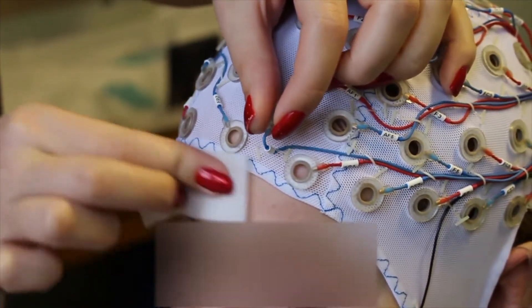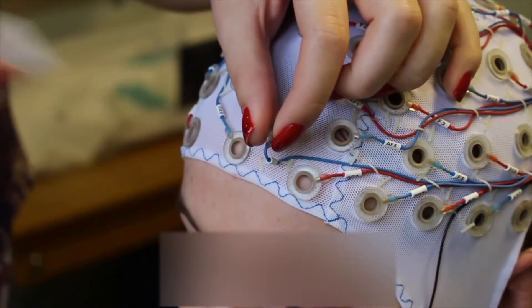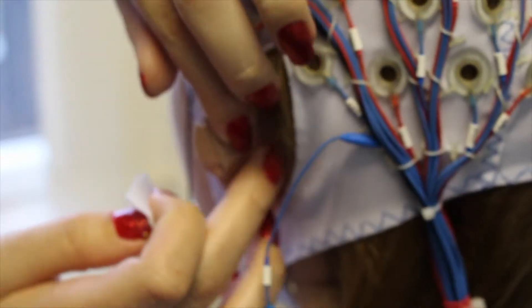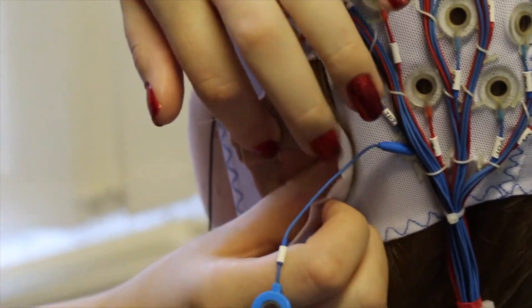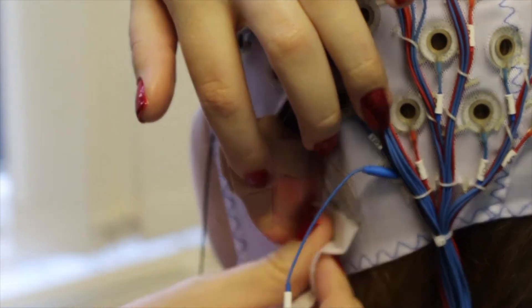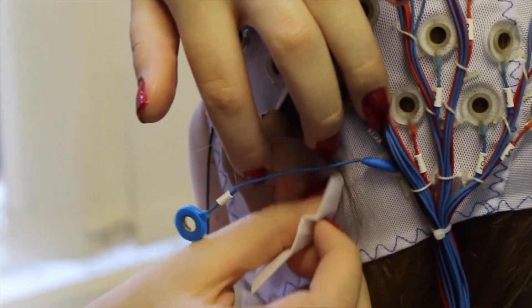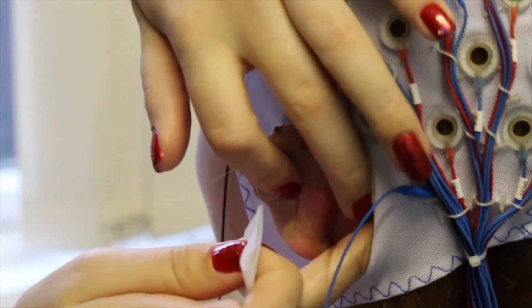Next, you need to prepare the skin on the forehead, chin, and behind the left ear or on the mastoid to attach loose electrodes. Do this by cleaning with an alcohol wipe. Ensure you've removed any makeup or oil from the area, and be especially careful behind the left ear as this is where the reference electrode will be placed.